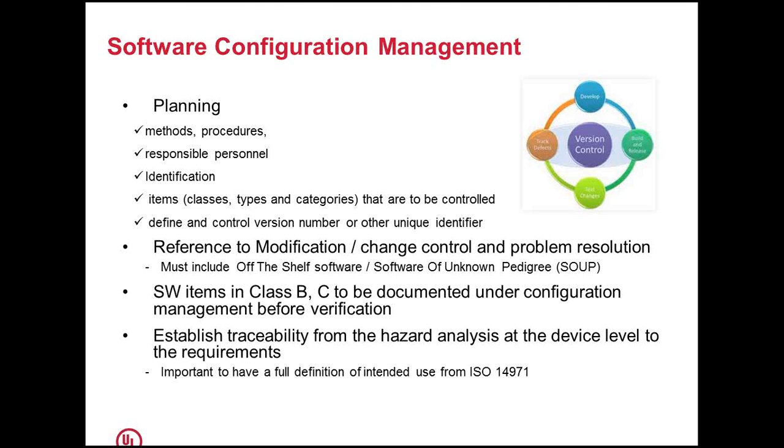Configuration management. First you need to have a plan in place on how you control the configuration. You need to have the procedures, identify who is the responsible person for this activity, and how you will identify what things you are going to control, and how the control number, version and all the unique identification will be done. And with respect to modification, change control and problem resolution, you need to also include the off-the-shelf software or any other software which you are not sure has gone through these processes.